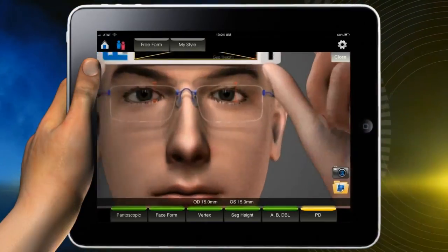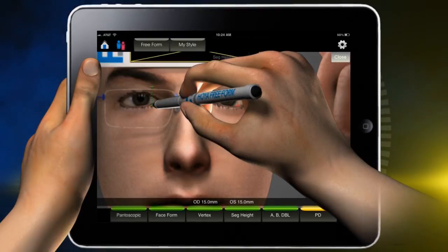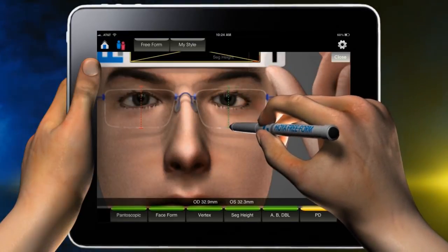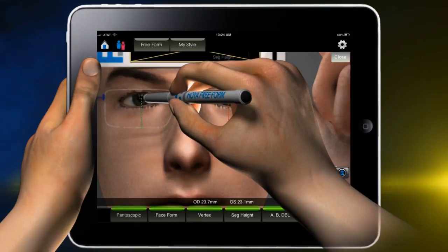Enlarge the photo and begin adjusting the seg height. Touch below the vertical red line until it turns green, then drag and position at the bottom of the frame. Touch above the vertical line until it turns green and position at center pupil. Repeat with the other eye.